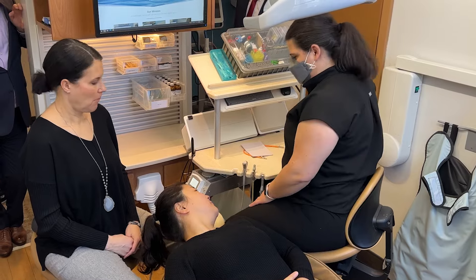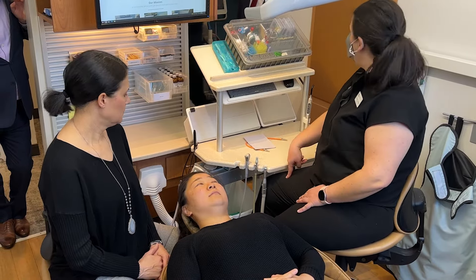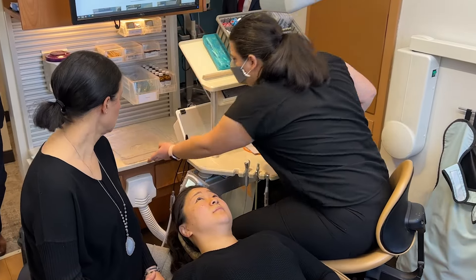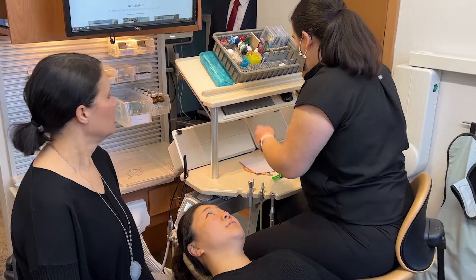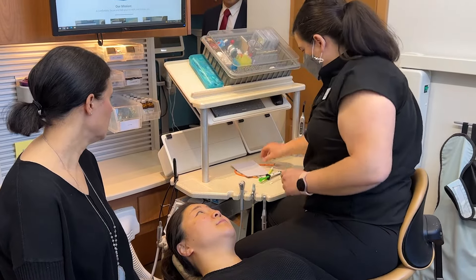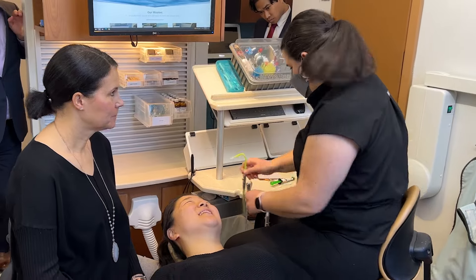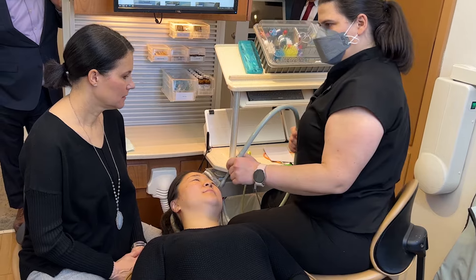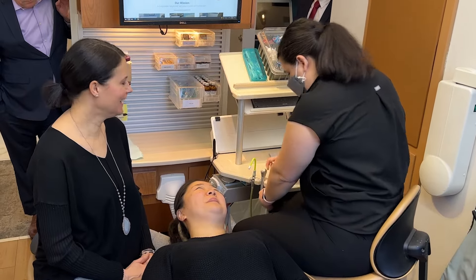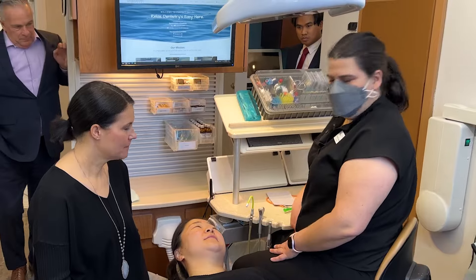I'm about five inches taller than she is. Go ahead and take proper position for yourself. I'll have one foot on the workstation, and then one foot on my ring, and then I'll roll myself closer so that I'm able to successfully bring a few things down. Aerosol use — we're going to close that up. And we're going to hook a suction if we needed to, and if I needed to use H-Vac, I could put that right between my legs and come through. I can remain in a full stand position and look straight down.